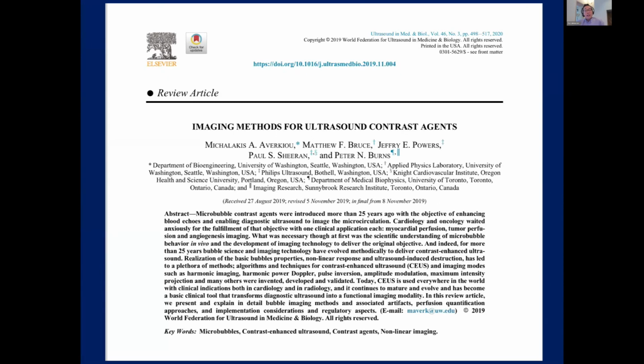It has been a challenge over the years for the ultrasound manufacturers to actually visualize where these contrasts are. And now we've actually managed to separate out the contrast agents from the grayscale itself on our B-mode image, as you'll see. The split screen image you'll see has taken many years of improvements by our manufacturing colleagues to improve the scanners that we use.